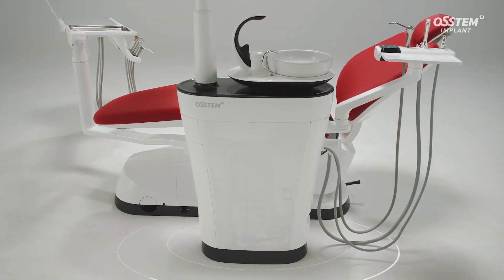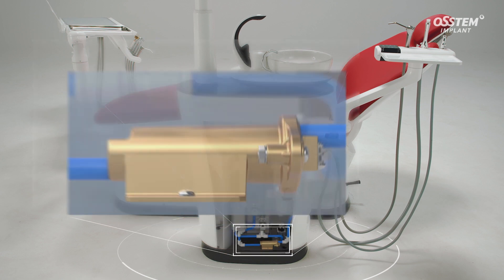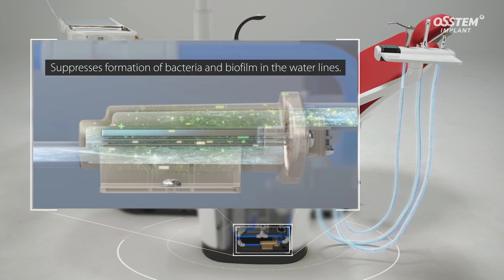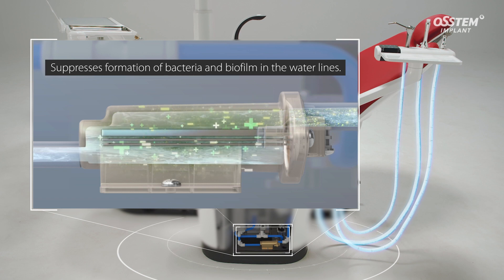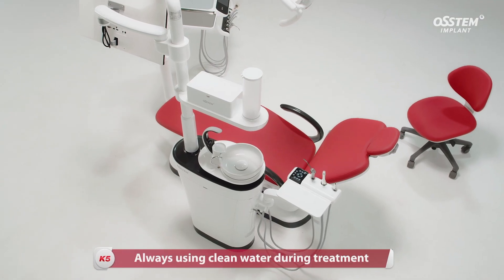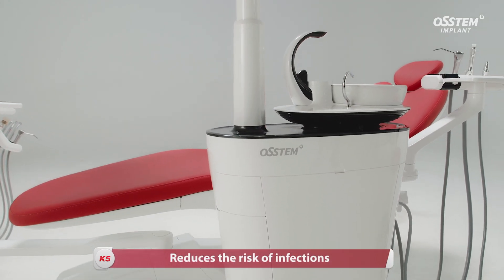The sterile water supply device suppresses the formation of bacteria and biofilm in the water line of the unit chair. Always using clean water during treatment makes it much easier to reduce the risk of infections.